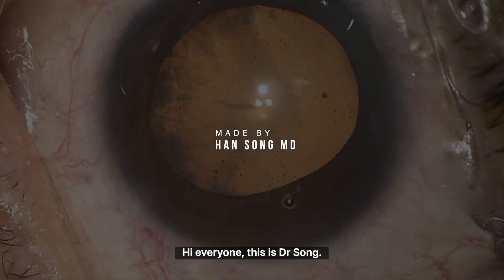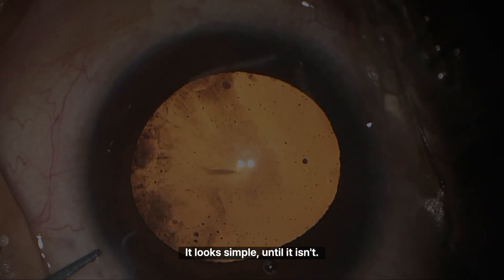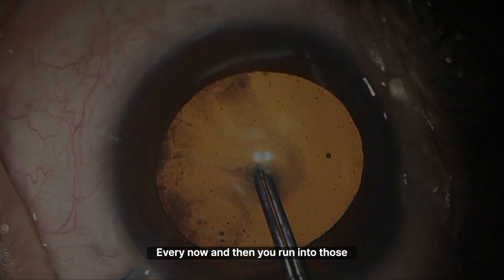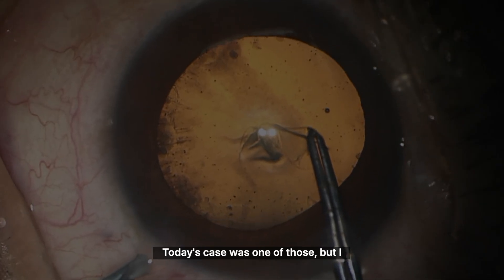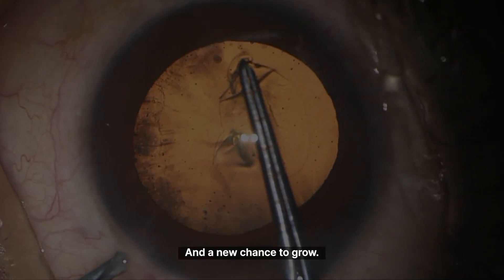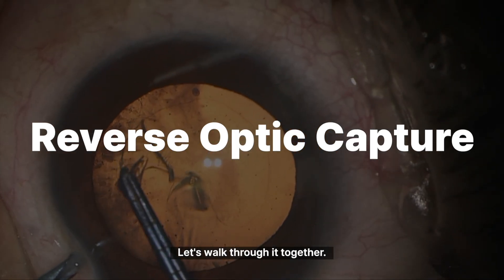Hi everyone, this is Dr. Song. With cataract surgery, the more you do it, the more you realise — it looks simple, until it isn't. Some days everything flows, other days it just doesn't. Every now and then you run into those head-scratching, almost unfair moments. Today's case was one of those, but I came away with another lesson and a new chance to grow. Today's topic is reverse optic capture. Let's walk through it together.